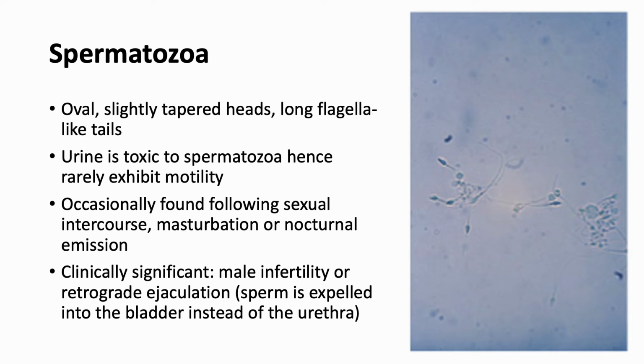This is when the sperm is expelled into the bladder instead of the urethra. The protocols for reporting the presence of spermatozoa in urine vary, so not reporting them may cite the lack of clinical significance or possible legal consequences.